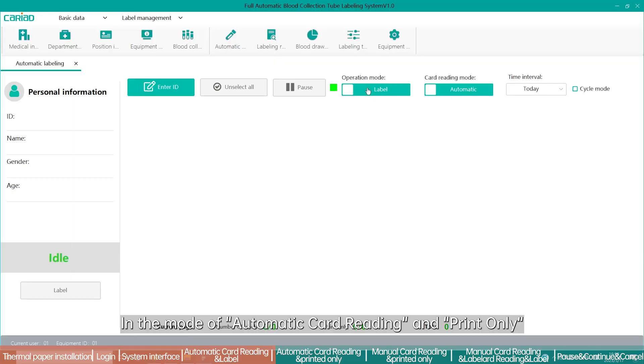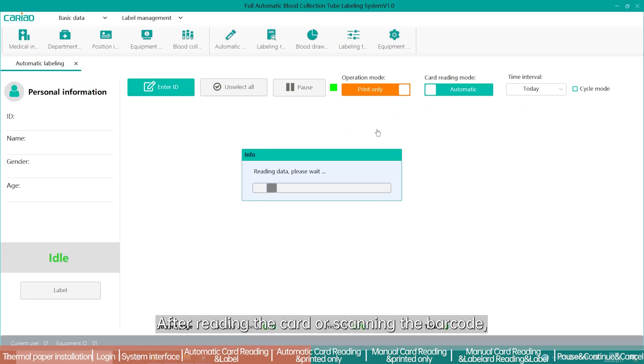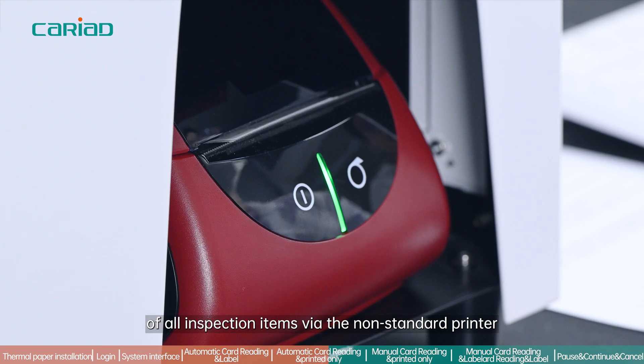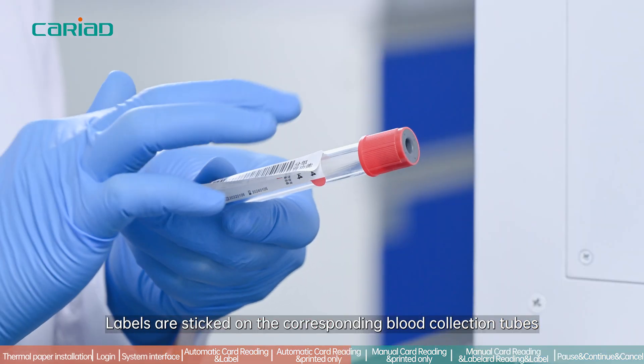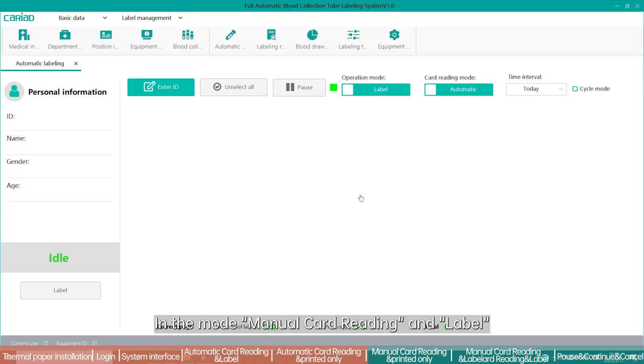In the mode of automatic card reading and print, the tubes are not automatically selected by the labeling system. After reading the card or scanning the barcode, the system automatically prints out the labels of all inspection items via the non-standard printer. Labels are then affixed to the corresponding blood collection tubes and containers by the operator.